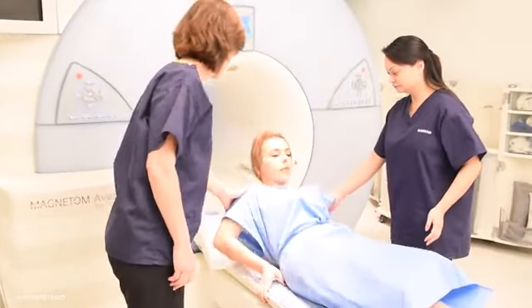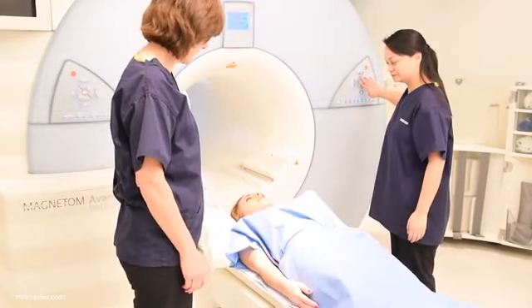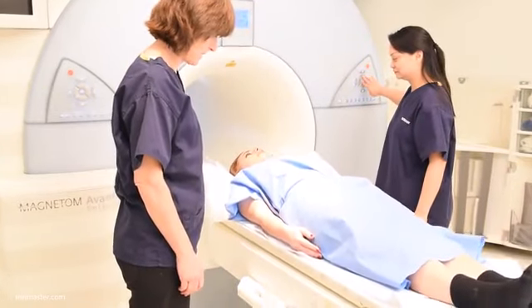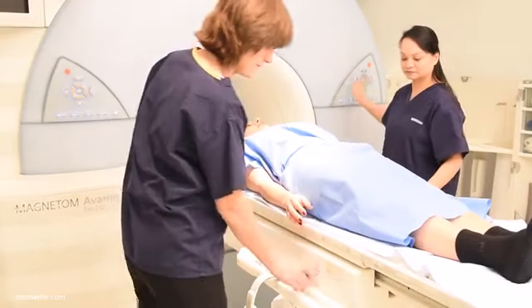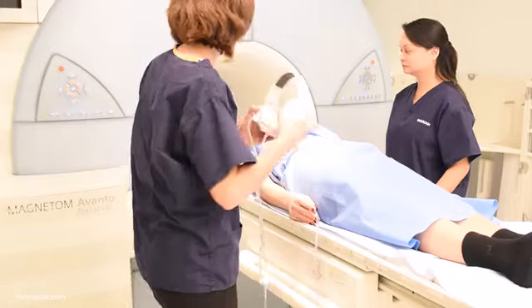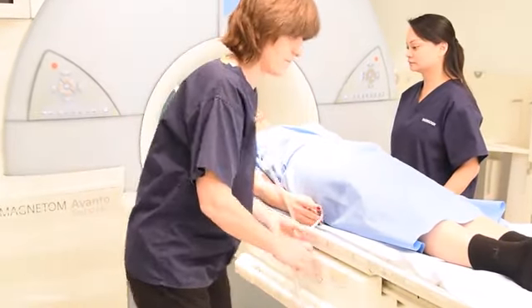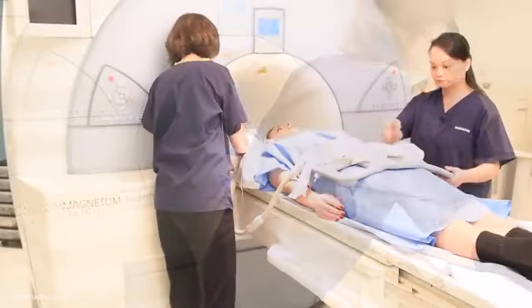Once the patient has been screened and can safely have an MRI scan, ask them to lie supine on the scanner bed with their head on a pillow. Provide an emergency buzzer. Provide headphones to reduce scanner noise in accordance with the manufacturer's guidelines.